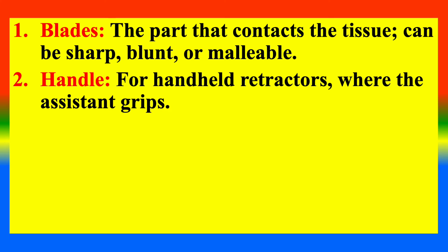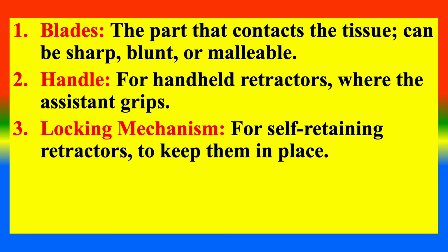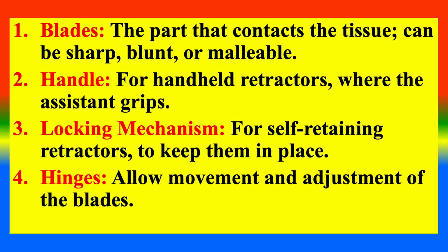Second, handle, for handheld retractors, where the assistant grips. 3. Locking mechanism, for self-retaining retractors to keep them in place. 4. Hinges, allow movement and adjustment of the blades.